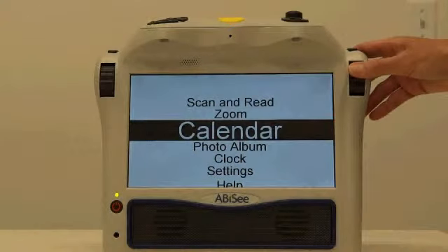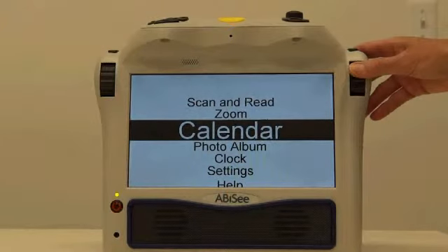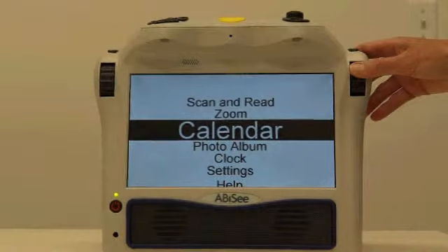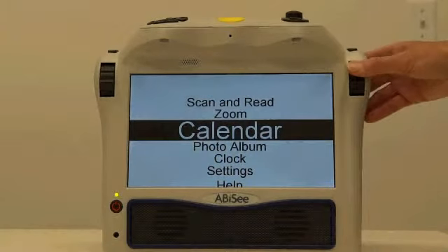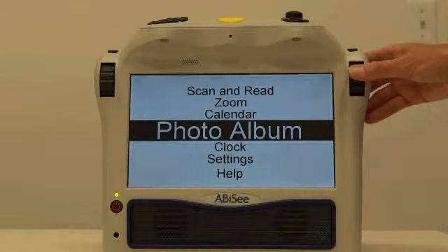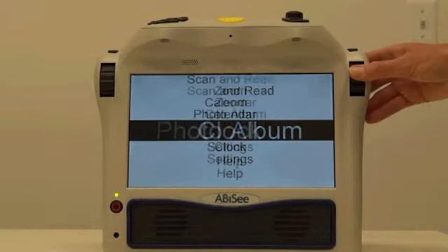Calendar. The Calendar application allows you to view or hear the current date and to create audio reminders for yourself. Photo Album. Select this application to view and magnify family photos like an electronic picture frame.